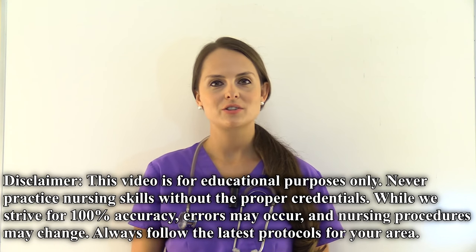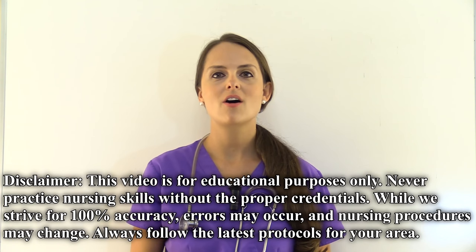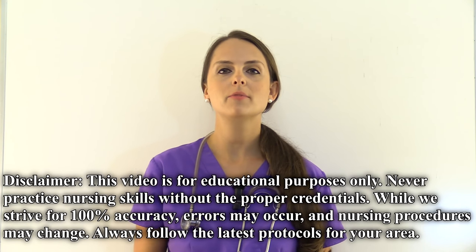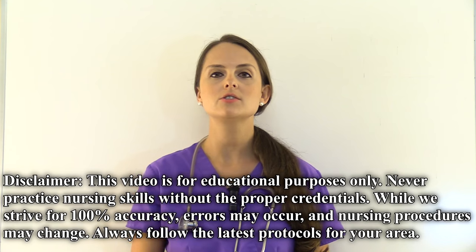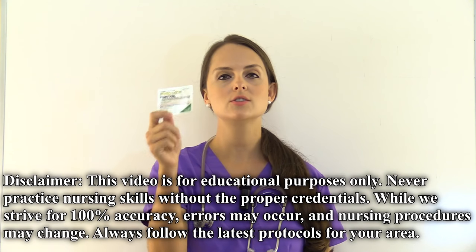Hey everyone, it's Sarah with RegisterNurseRN.com and in this video, I'm going to demonstrate for you how to administer a transdermal patch, specifically fentanyl.